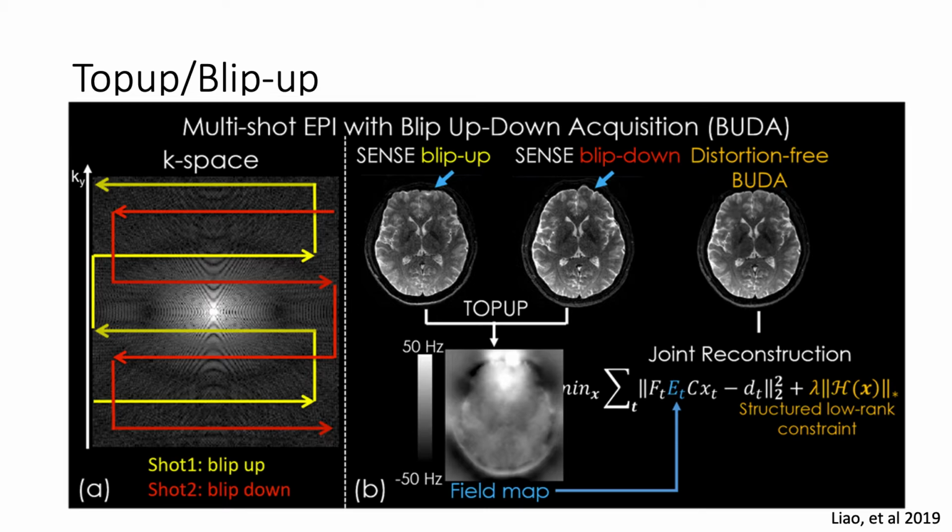And then I'm pretty sure there are two different methods for using these. One, like I said, you can acquire them separately, then apply them to your collected data, so the two different scans, or acquire the blip up and down images and then merge them together in a single file and correct it that way. There are pros and cons to these different methods, as always.